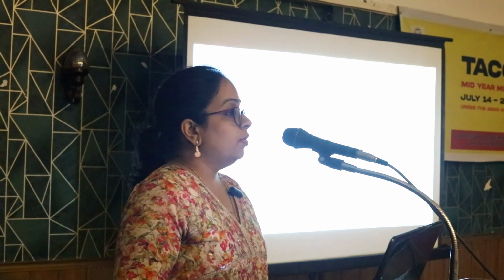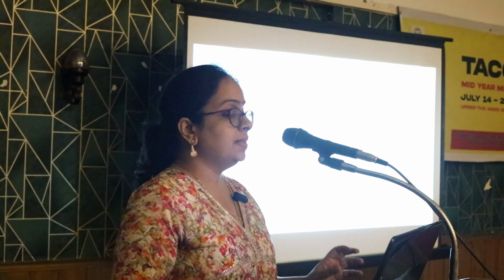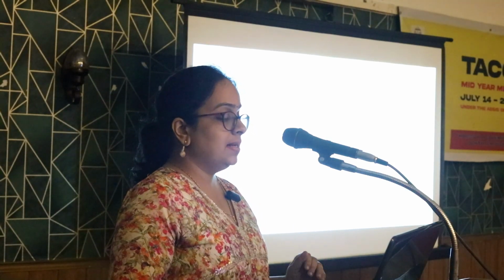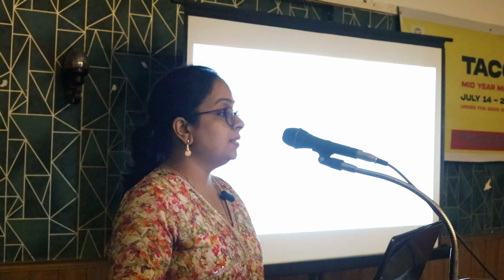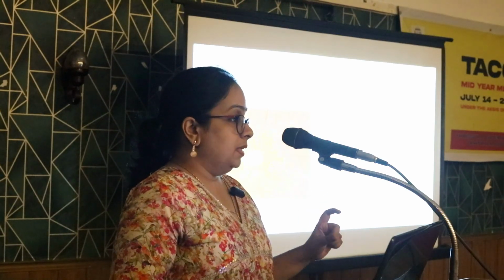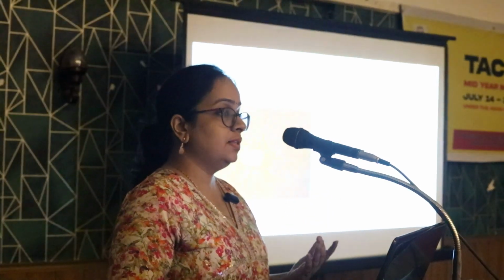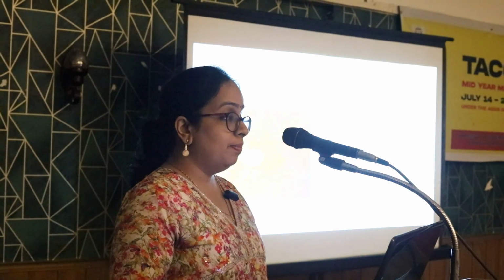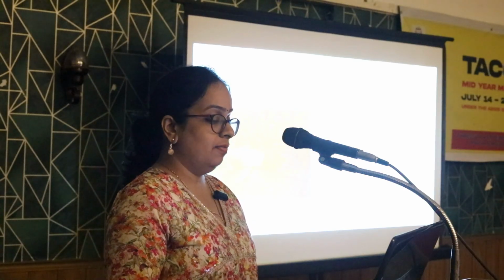Diagnosis of glaucoma basically consists of analysis of the structural changes and the functional changes. Structural changes are assessed by optic nerve head analysis and OCT analysis, and the functional changes by visual field analysis. When you analyze the optic nerve at the slit lamp with a 90D or 78D lens, the important factors regarding glaucoma are the neuroretinal rim and the retinal nerve fiber layer.